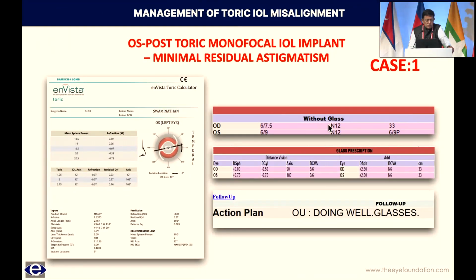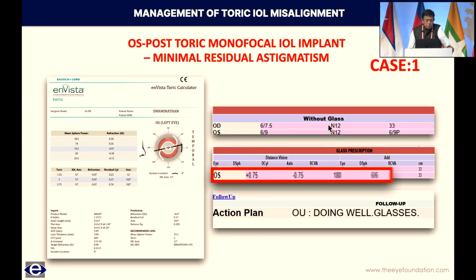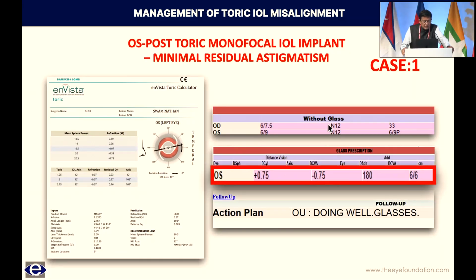As far as coming to some real life scenarios is concerned, case 1, most importantly, I always emphasize, whether it's cataract surgery or refractive surgery, ask my optometrist not to go after those small powers if the patient is happy.